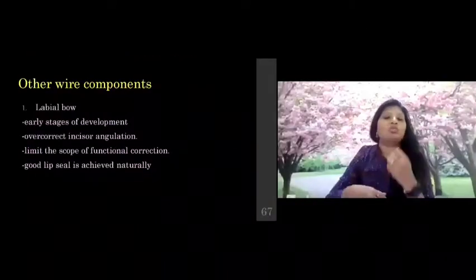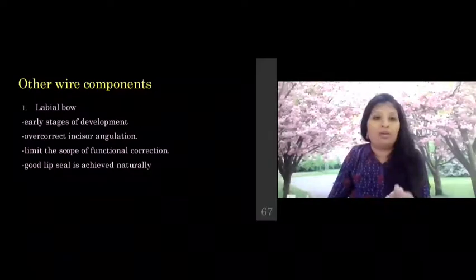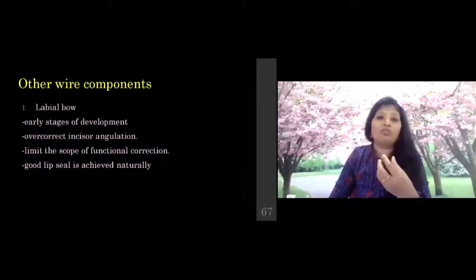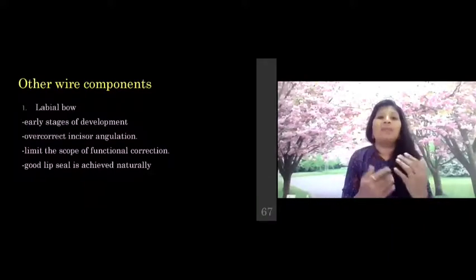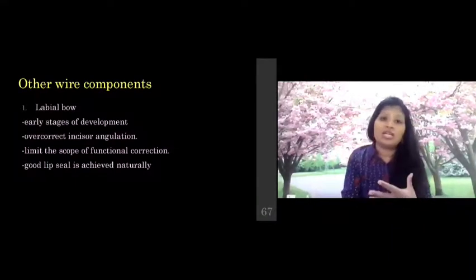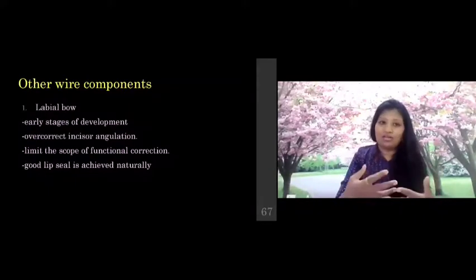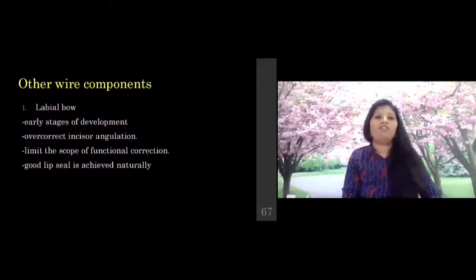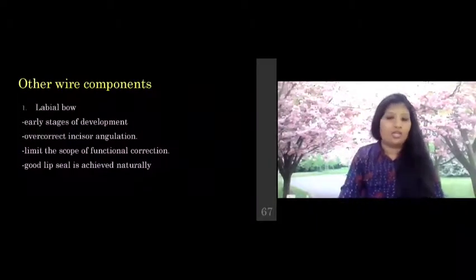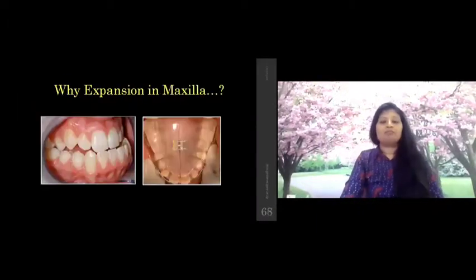Because of that, certain times you should not give labial bow. And apart from that, when you bring the mandible forward, you are naturally making the face appear normal. Lip seal is achieved without any need of your labial bow. That's why we feel that labial bow is not always necessary. If it is necessary, then you can incorporate it.